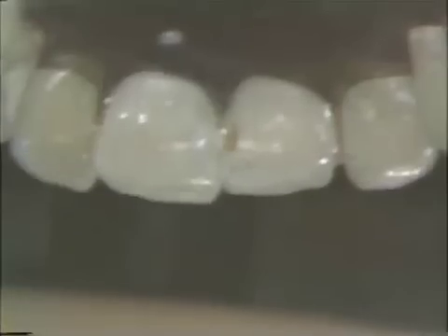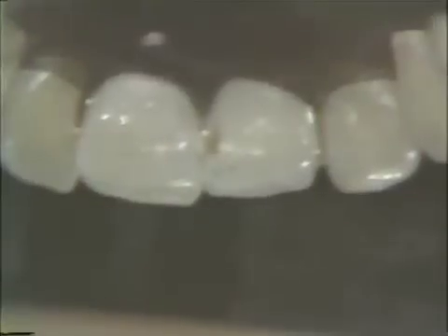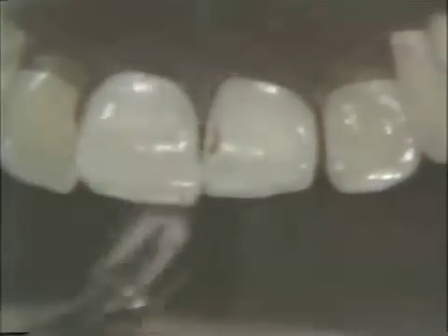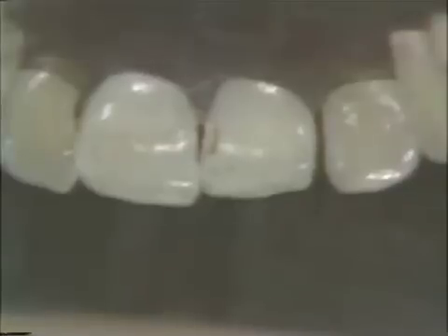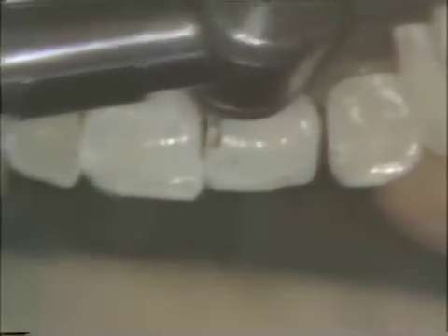Now, it is well to stop once in a while and look, dry it out, and look at what you have done. We're now drying it out. If you will notice now, there is decalcification still in the labial portion of this preparation. But we are cutting a normal situation.